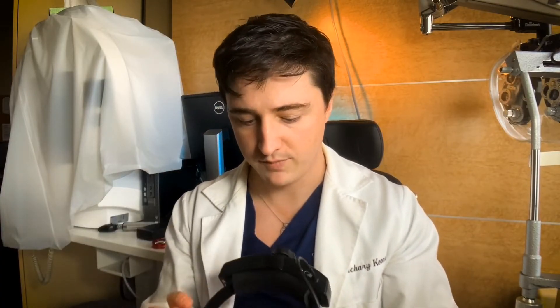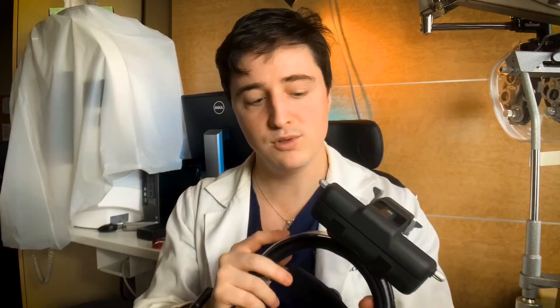Set the brightness as bright as you need to see, but not so bright the patient can't tolerate it — that depends on the patient. That's the ins and outs of how to use the indirect ophthalmoscope. It's going to require practice and will be tough at first, but just keep at it.